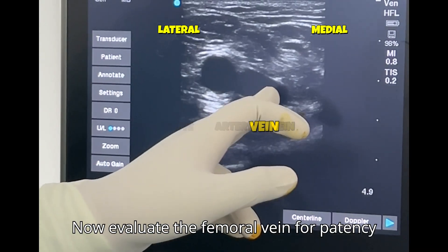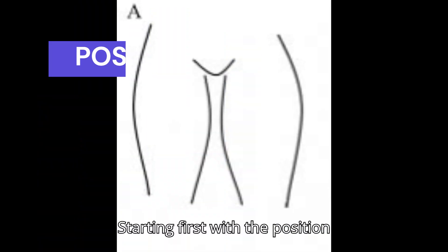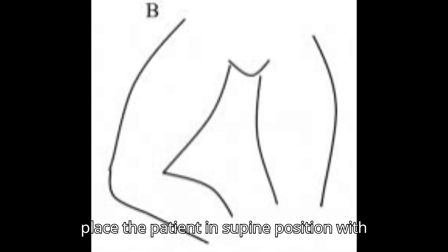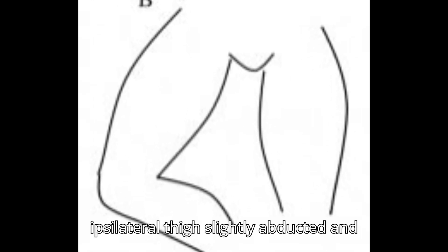Evaluate the femoral vein for patency and compressibility. Starting with the position of the patient: place the patient in supine position with ipsilateral thighs slightly abducted and externally rotated.